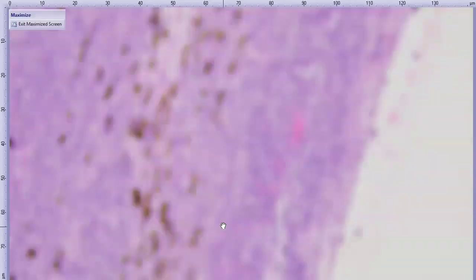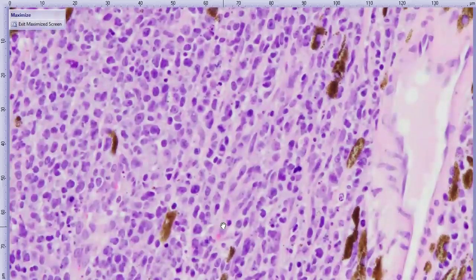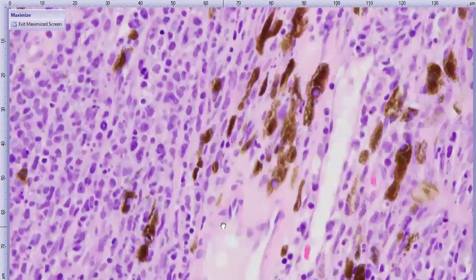nucleolus. If we go to other parts of the tumor, in particular down here in the choroid, they become a little bit better preserved. Maybe, sort of. And they look a little bit more obviously round. But similar features. The neoplastic nuclei tend to be maybe about 1.5 erythrocytes to 2 erythrocyte widths in diameter, which is useful for later. Here are some erythrocytes we could use as rulers.